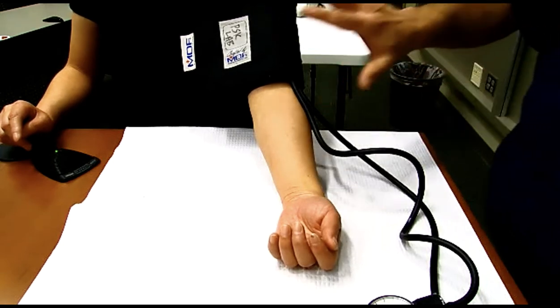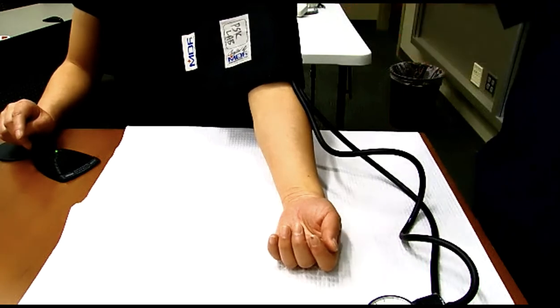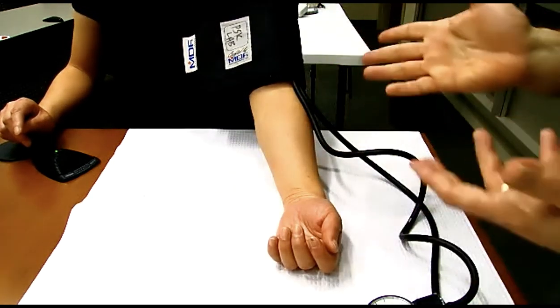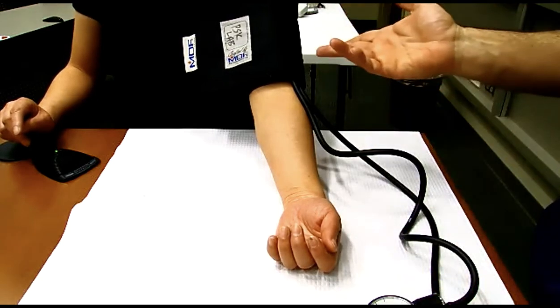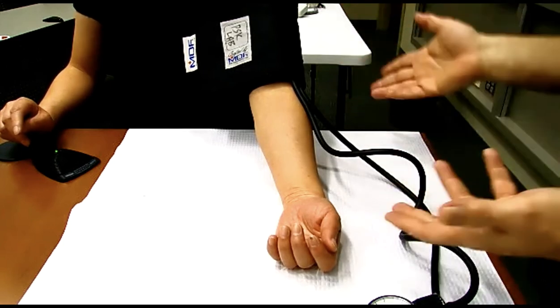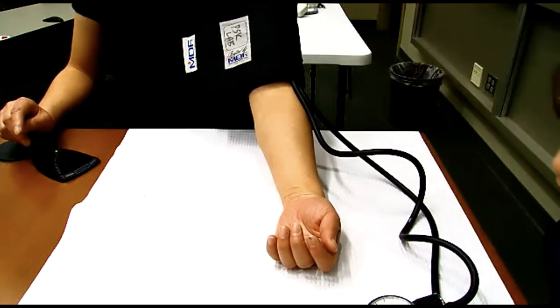Because here's the deal. I do not know how high to pump up the blood pressure. Remember, we take blood pressures by going above systolic and then deflating down. So how high do I know to do this? Well, most people, let's just go up to like 250. Would that be okay? Why would Judy not be my friend anymore if I pump this up to 250? Oh. It's very uncomfortable. So we don't want to cause more discomfort than we need.